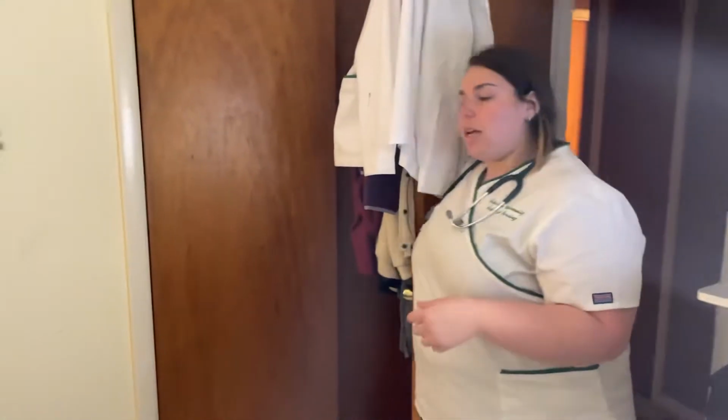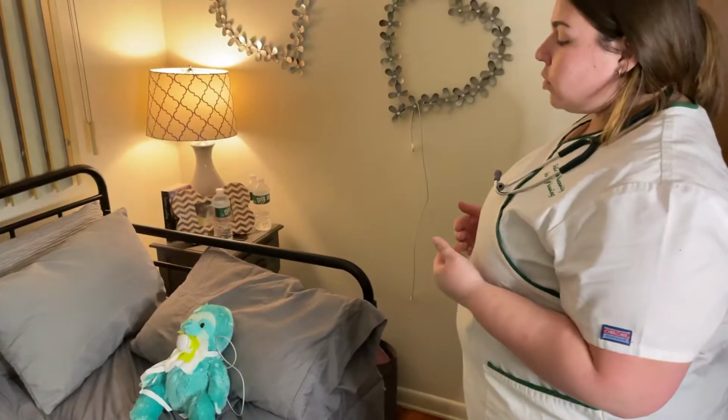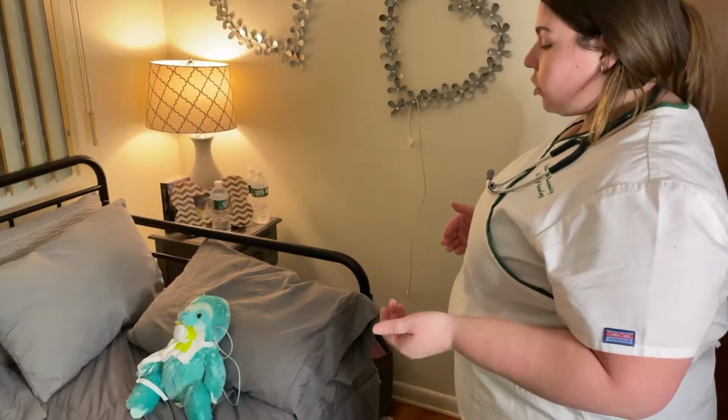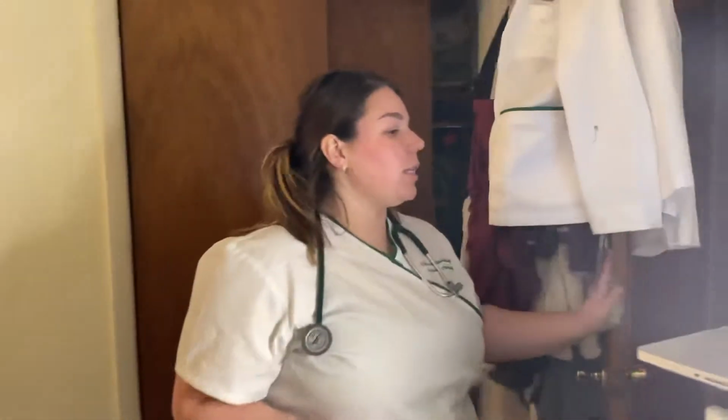Hi, Mrs. Gerban. How are you? My name's Ashley. I'm going to be your nurse today. So today we're just going to do some trach suction and trach care. So I'm going to close the door first to provide some privacy and perform some hand hygiene.